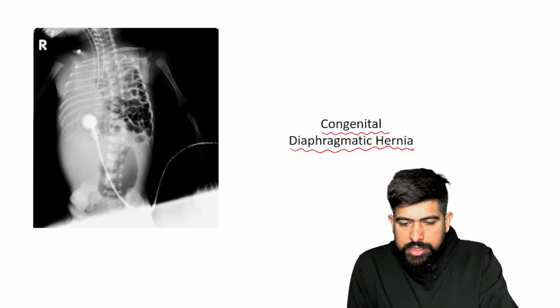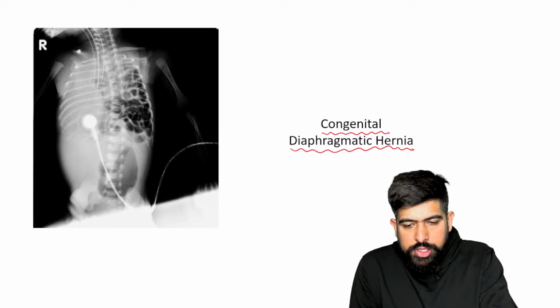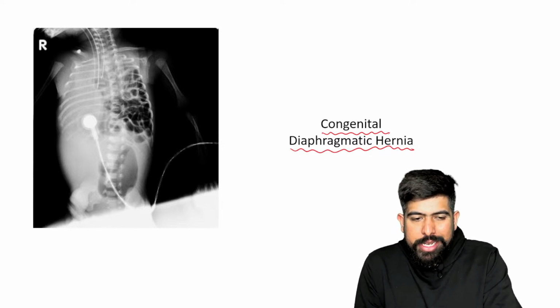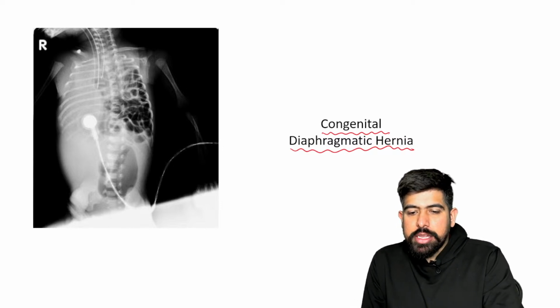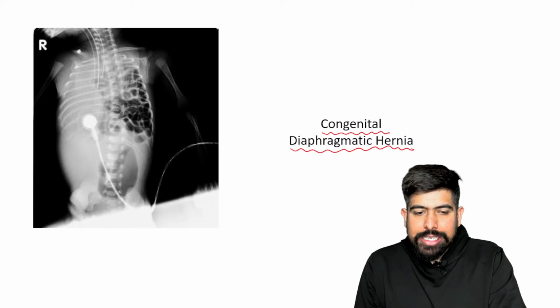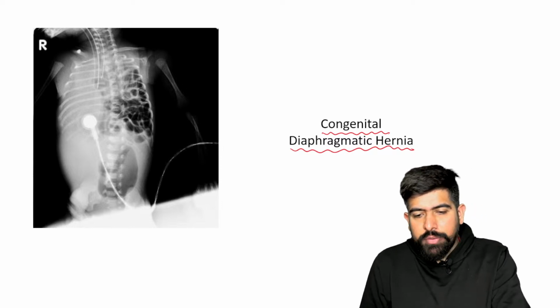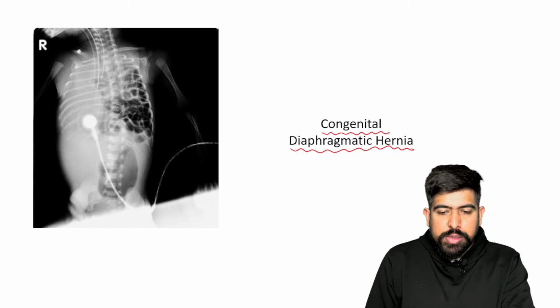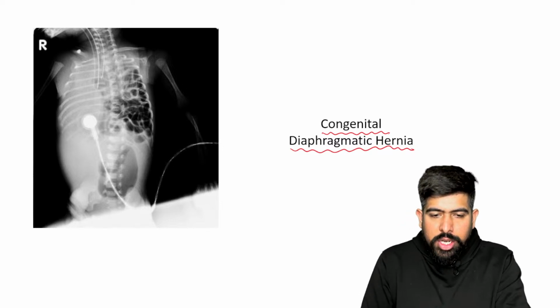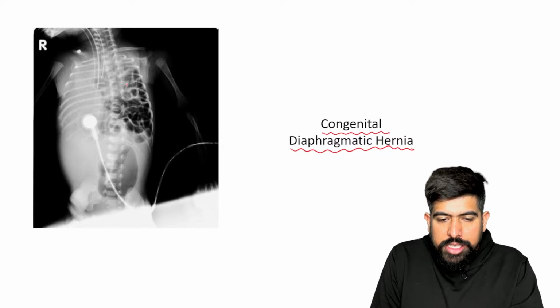Yes, Bochdalek hernia, I agree with you. You can also say the soap bubble appearance. There is a bubble, or the intestine, in the thorax, with the lungs. So the intestine moves up above the diaphragm in congenital diaphragmatic hernia. But what is happening in this condition, you can see here. This is the intestine.